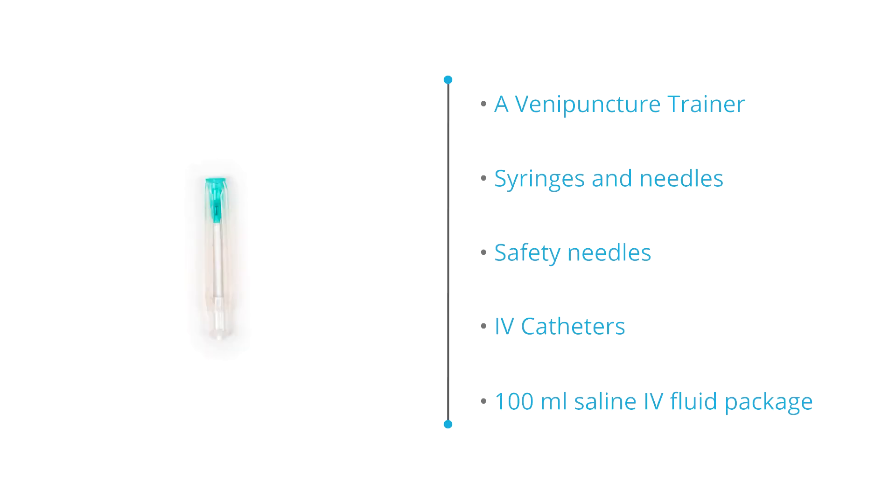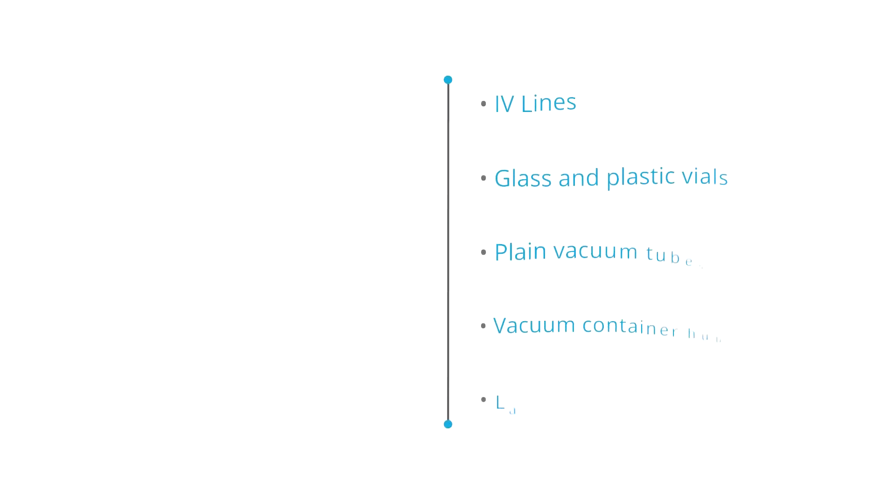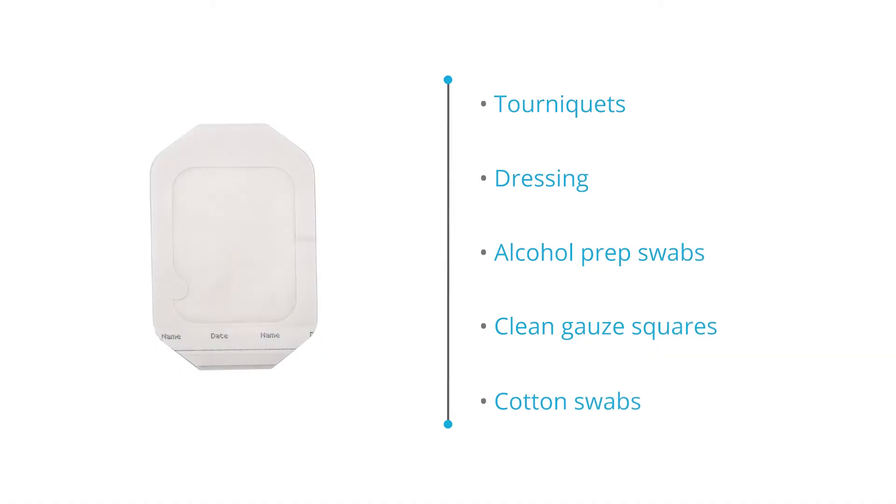of various sizes, safety needles, IV catheters, small 100 milliliter saline IV fluid package, IV lines, glass and plastic vials, plain vacuum tubes, vacuum container hub and needles, lancets for piercing the skin to sample capillary blood, and tourniquets of various types.